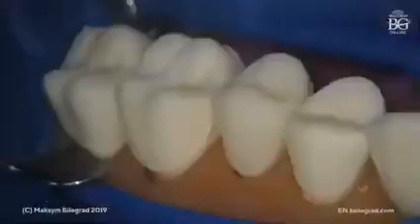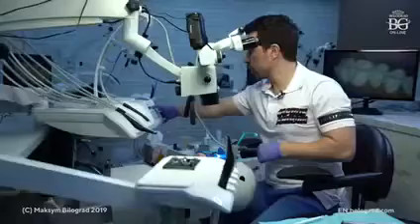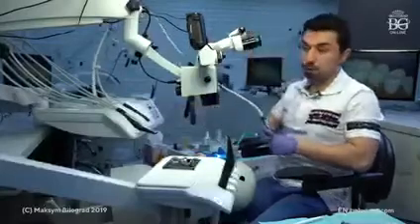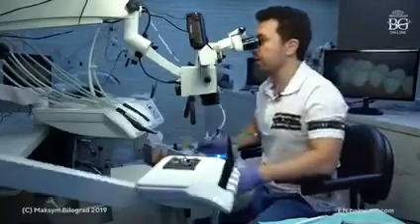We will take our contra angle one, with disc, and we will make all the surfaces really smooth with disc. We put 5000 RPM for disc. I prefer to use Soflex discs by 3M, the orange ones, not the red. The red is the coarse one. The second one is orange, I think.